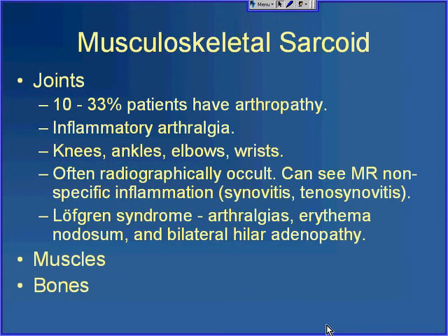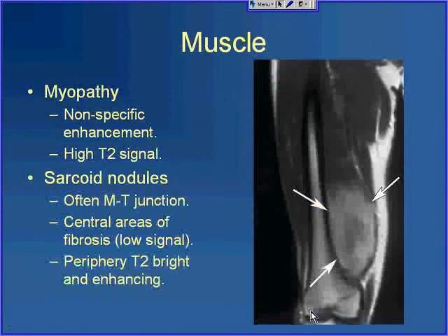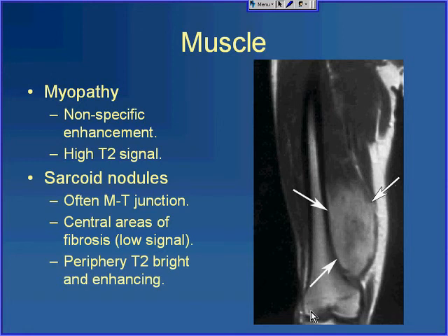Muscle involvement has two main forms. One is a nonspecific myopathy where you see high T2 signal — hyperenhancing edema in the muscle. The second form is sarcoid nodules, which are quite rare. These tend to occur at the musculotendinous junction. They have a central area of fibrosis, which is low signal on all sequences, with a periphery of enhancement and edema — bright on T2 and bright on post-contrast imaging.